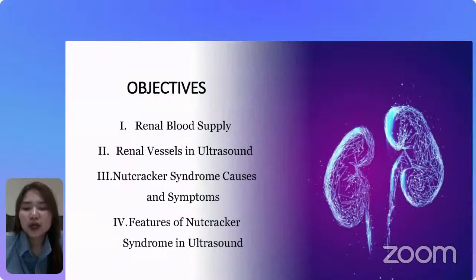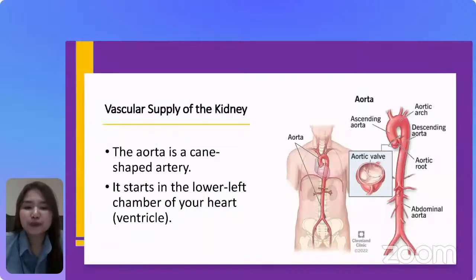The following are the goals that are intended to be achieved in this learning experience. The primary objectives are to learn the renal blood supply, the renal vessels in ultrasound, nutcracker syndrome causes and symptoms, and the features of nutcracker syndrome in ultrasound.